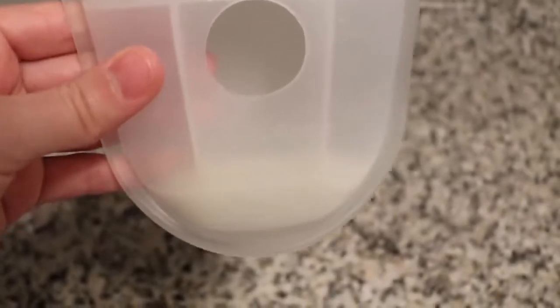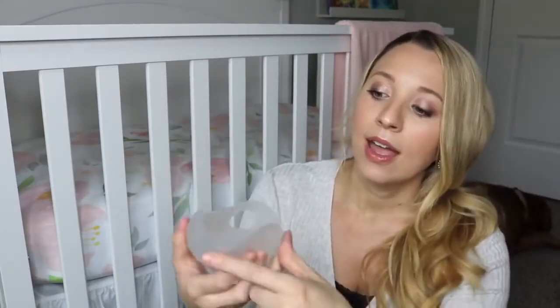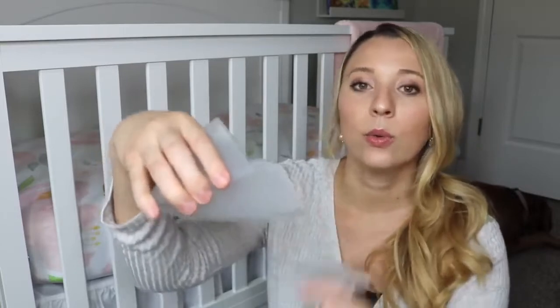Instead of wasting all of that precious milk, it's being saved in this and then I can freeze it. It's silicone as well, very flexible, and it has this cap right here that creates — not a suction — but it keeps everything nice and open so that your nipple doesn't get smooshed. When you're done, you just take this out. This creates almost like a cone or funnel shape at the tip and then you just pour it into your bottle or into your milk bag to freeze it.